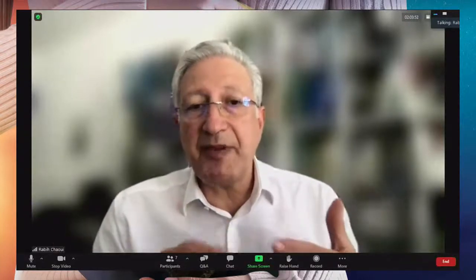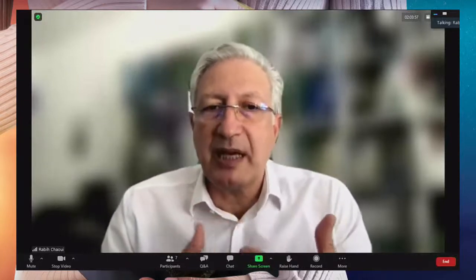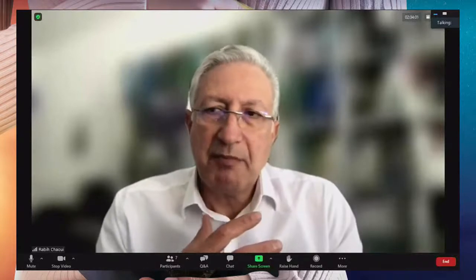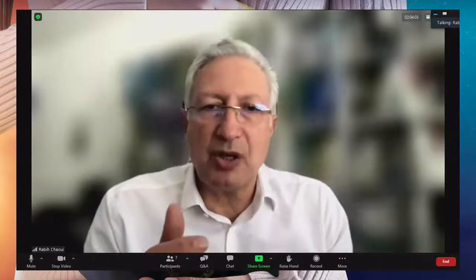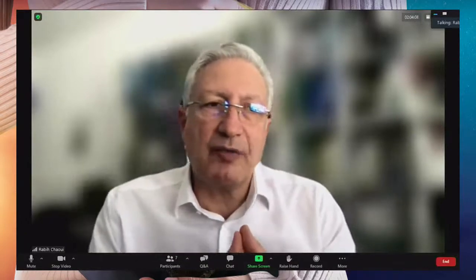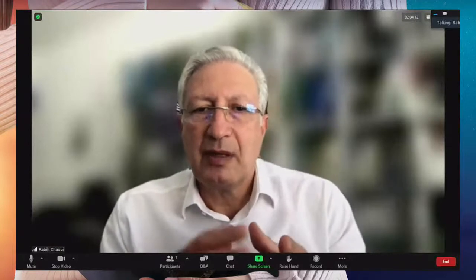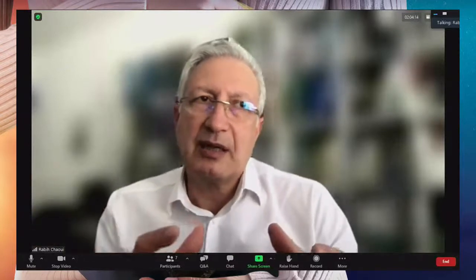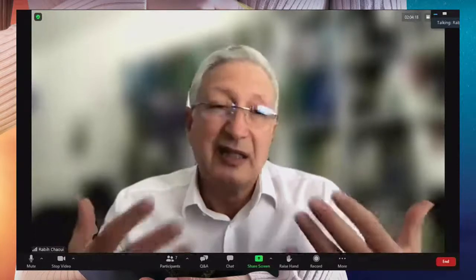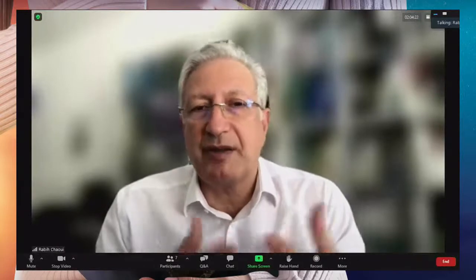It is the same fetal position where you see the face. I cannot imagine that you send any woman home without having a profile. Many people in the world are concerned about Down syndrome, but the chance of having Down syndrome, if you are younger than 34 years old, is 1 in 300 and less. So the chance of having a cardiac problem is larger than Down syndrome. This is why I insist on having at least the 4-chamber view in color and the great vessels crossing.